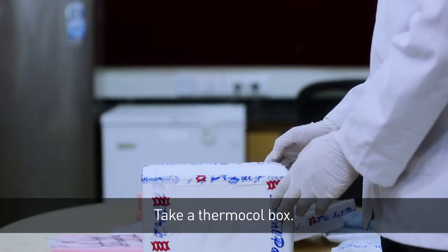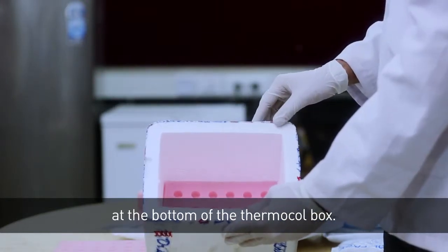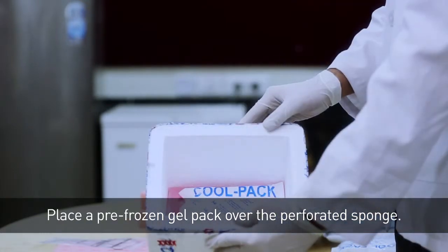Take a thermacol box. Place a first layer of perforated sponge at the bottom of the thermacol box. Place a pre-frozen gel pack over the perforated sponge.